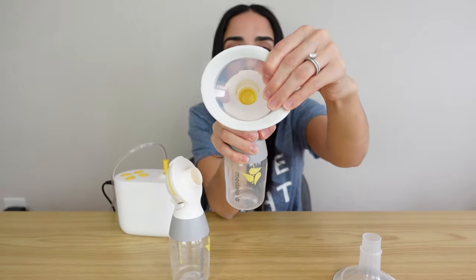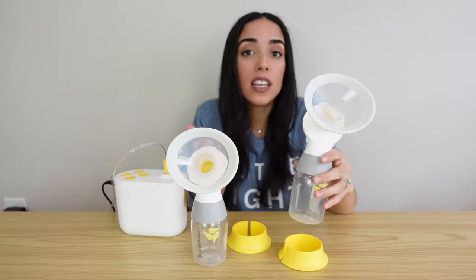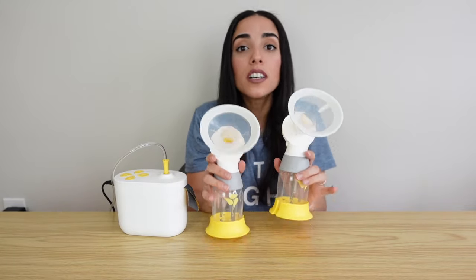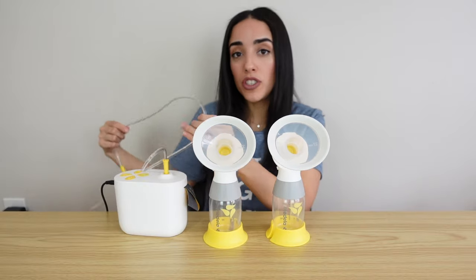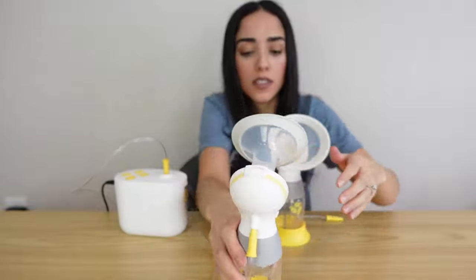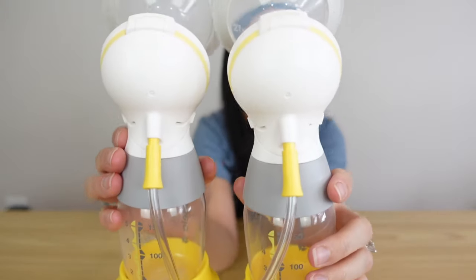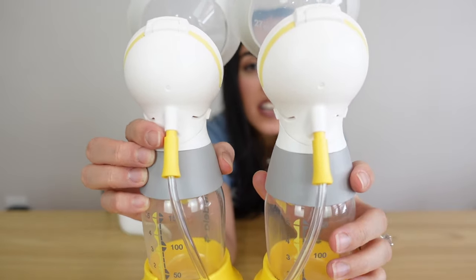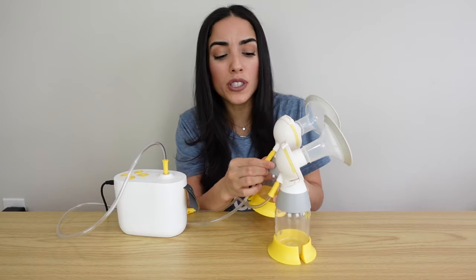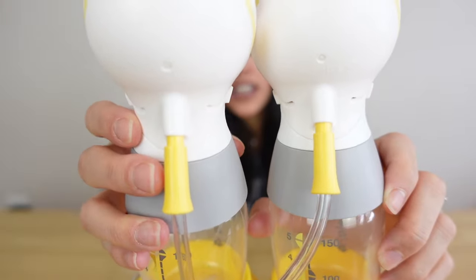I personally pump with them vertically. I also personally like to pump with the stands on the bottom, though you don't have to — they're nice for when you're done pumping and storing your milk so you won't have to worry about your pumps falling over. Now take the tubing connected to your motor and place them into the back of your connector pieces. Note that they don't go all the way inside and they're meant to be that way — don't try to force them in. That is your fully assembled pump.